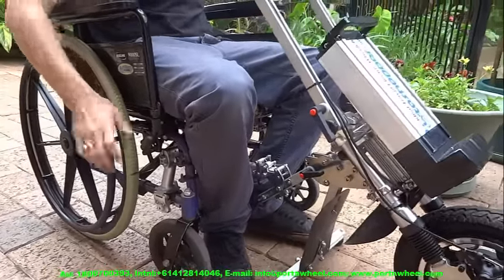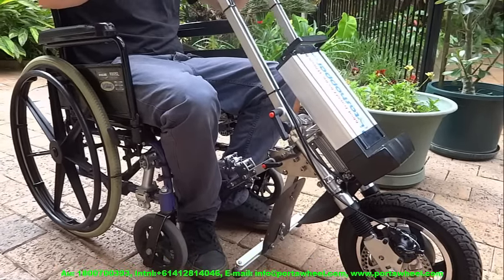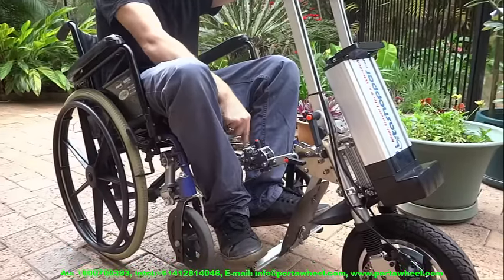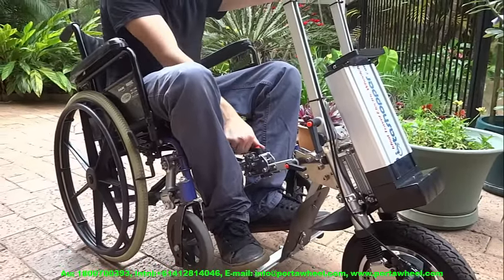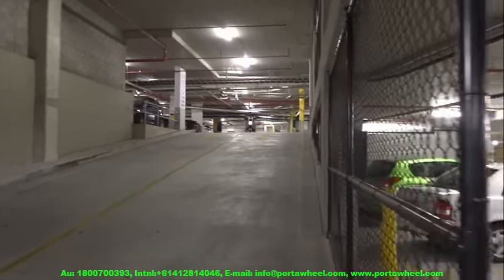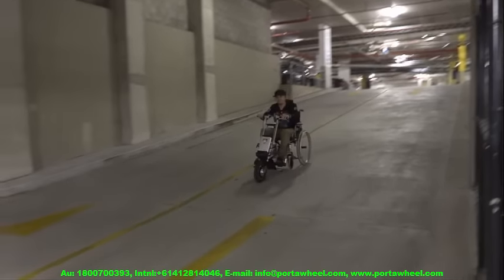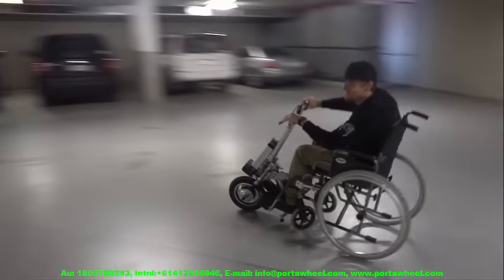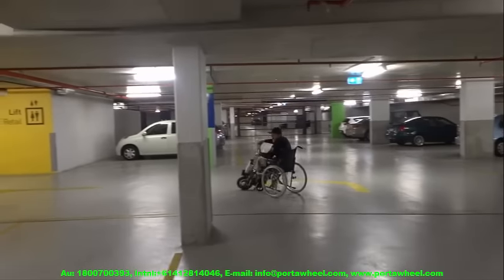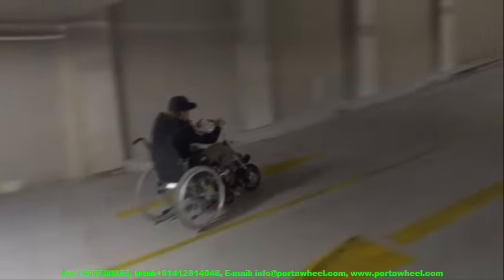The PortaWheel can go further, faster, and over rough and hilly terrain that most mobility scooters find tough or impossible. Best of all, you can pop it in the car boot, and once you've parked, lifting the PortaWheel out and hooking it to your wheelchair is very simple. Once you're in it you become the king of the road — you can take the ramp, the elevator, the train, the tram, or the plane. On the streets, the PortaWheel comes alive and offers mobility that even able-bodied people find hard to believe.